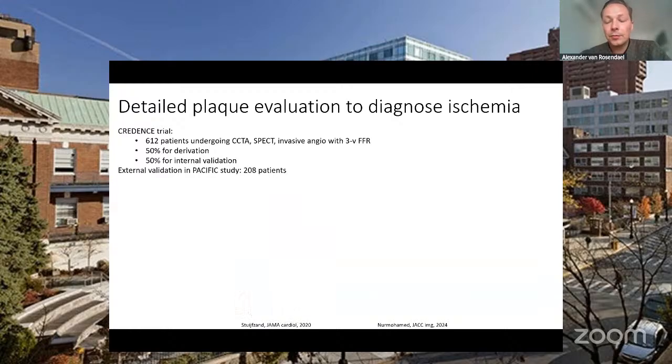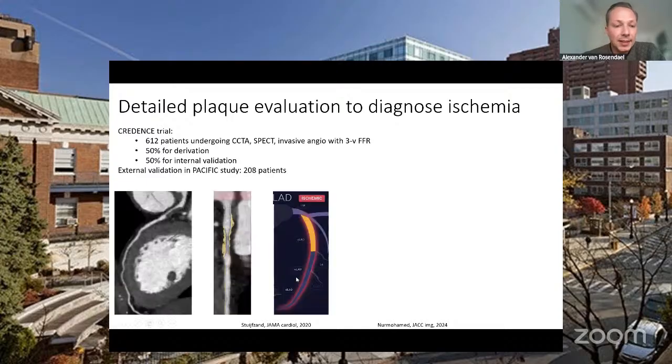So this is another thing that this talk is not about, but the plaque burden from the coronary tree is also a very strong surrogate for ischemia. It predicts ischemia very well. This is a case. There is a LAD with of course a very high lumen narrowing with plaque. And when you combine all these plaque features together, you can get an AI-QCT ischemia algorithm, and that predicts that this lesion is ischemic.